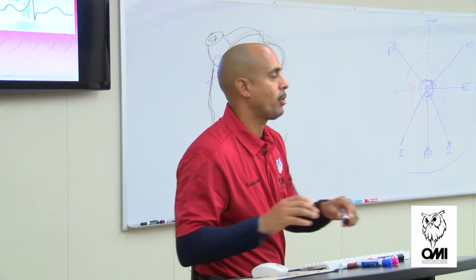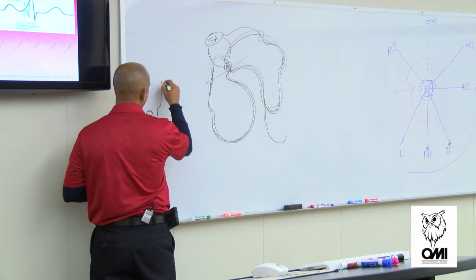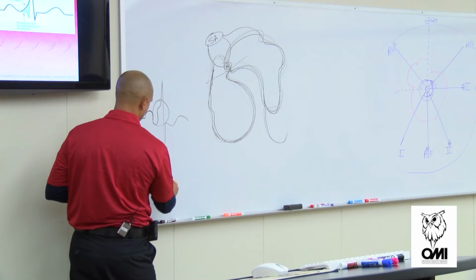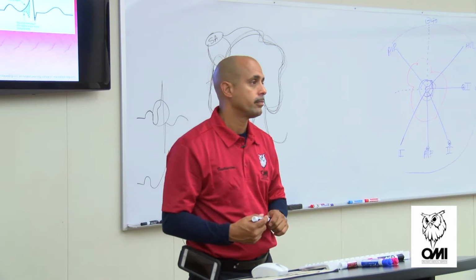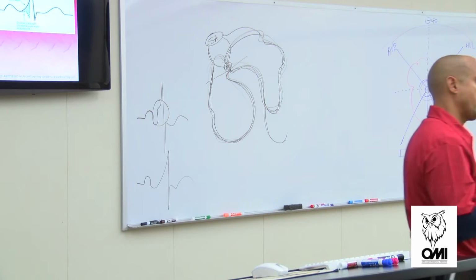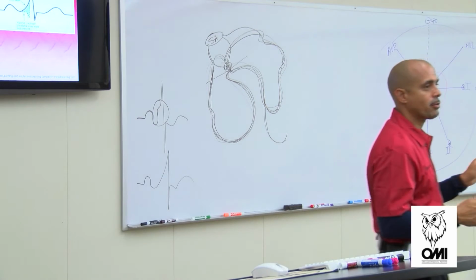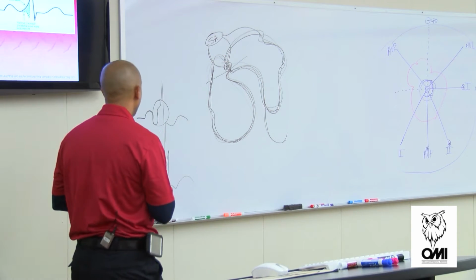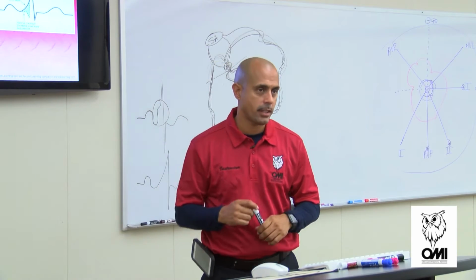All you're looking for is one or two things. We're looking for the delta wave. It slopes right in. You're going to see that delta wave, or it's going to slope. You should be able to see it, but if you can't, what can you do? Slow it down and depress the print. Okay? All right, very good. Now, that's WPW. Any questions as far as that's concerned?